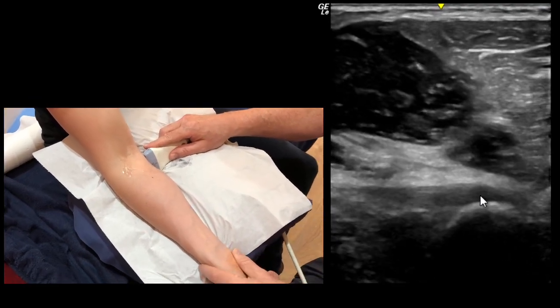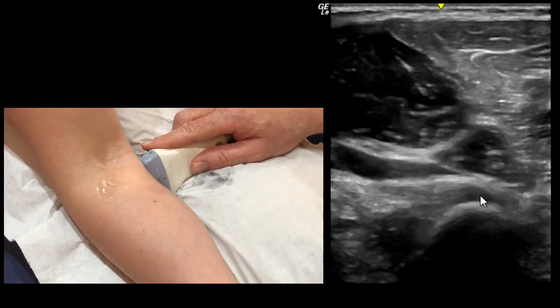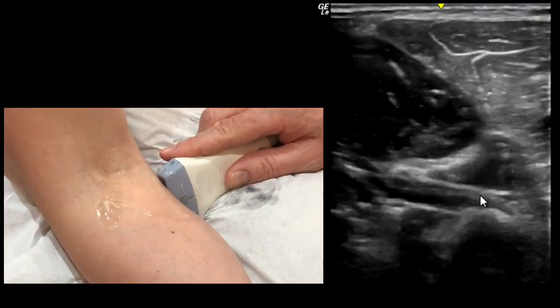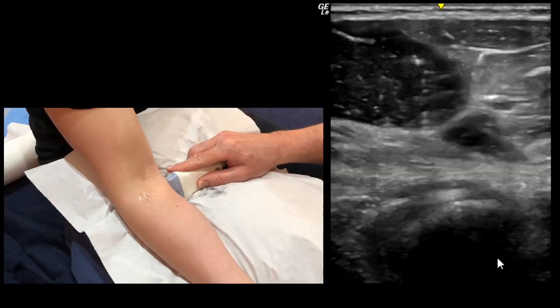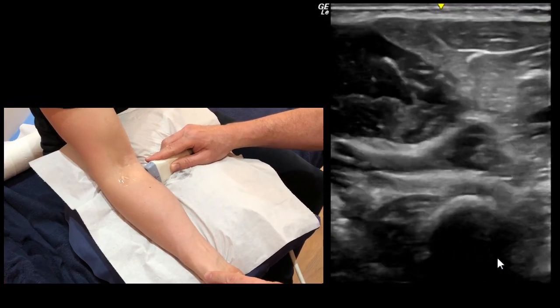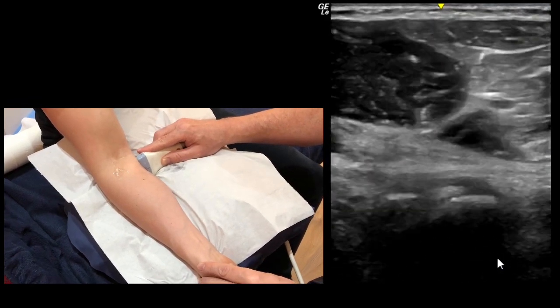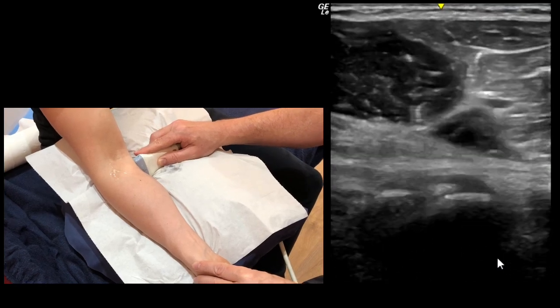Rotate round to bring the tendon into view right up to the insertion, and move the cursor out of the way. Always push all the way through the tendon because there are two parts, and in some patients you see a nice clear definition between the long head and the short head portion of the tendon.